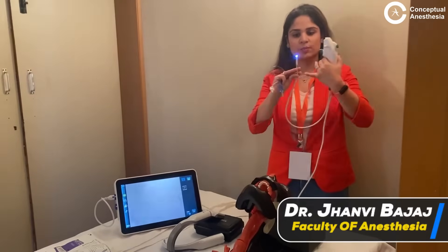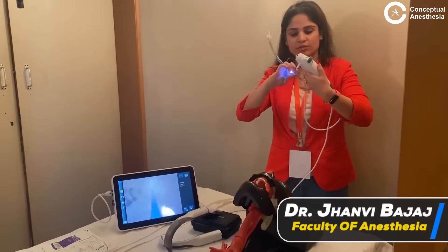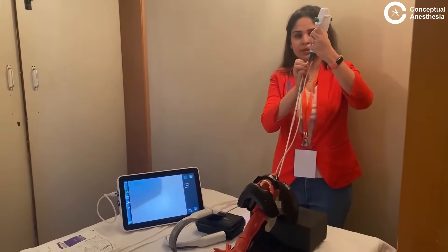This is a fiberless scope — I can turn it. I take a size 6.5 endotracheal tube, load it onto the scope, and fix it well.